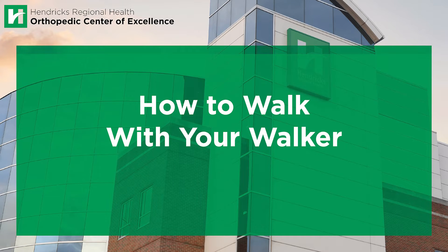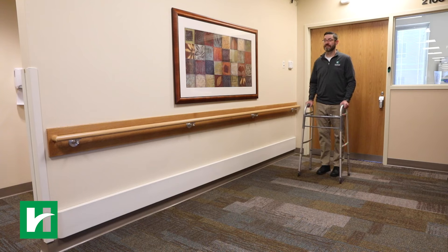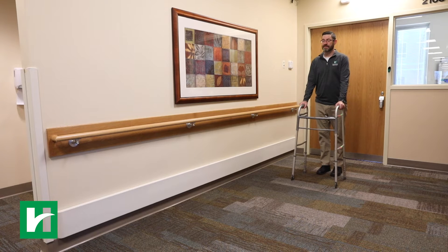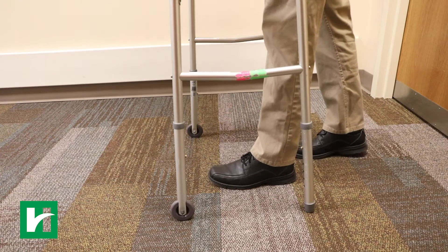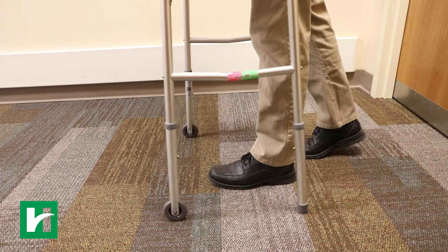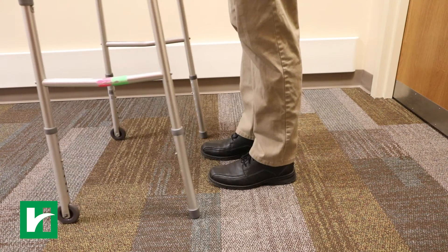How to walk with your walker. Move the walker forward. With all four walker legs firmly on the ground, step forward with the operated leg. Place the foot in the middle of the walker area. Do not move it past the front feet of the walker.